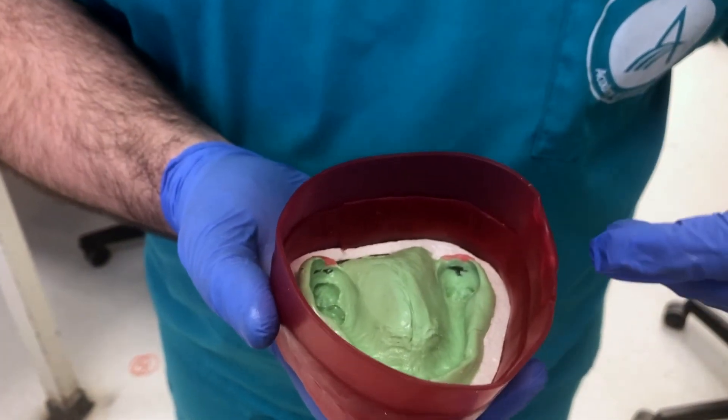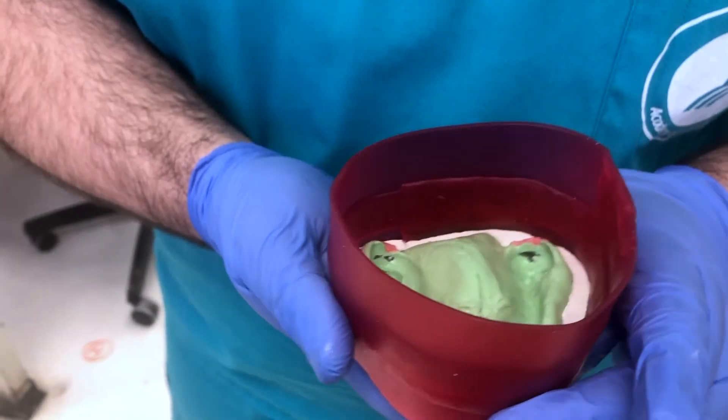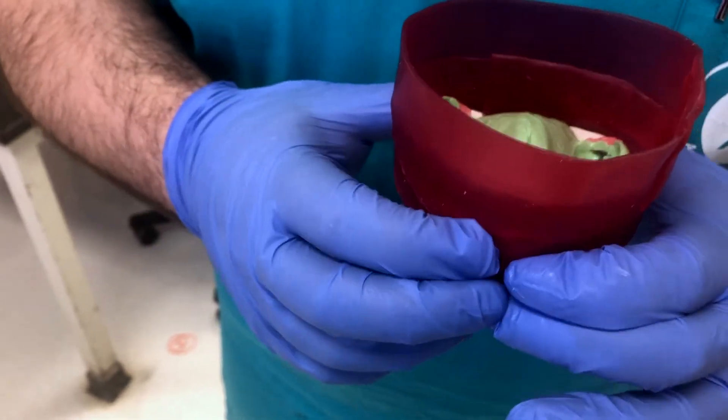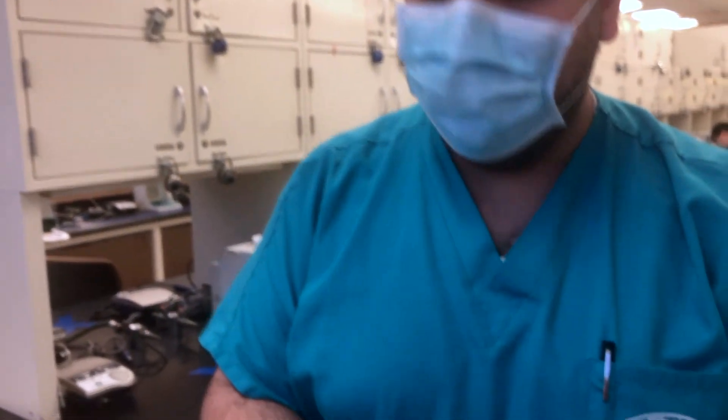The next step will be to pour it up in MicroStone. I'm not going to do a video on that — you guys know how to pour up with MicroStone. Ideally, you want to use the vacuum mixer for this, but we don't live in an ideal clinical world. So use your own discretion whether you want to use the vacuum mixer or just hand mix it really well with a little extra water.